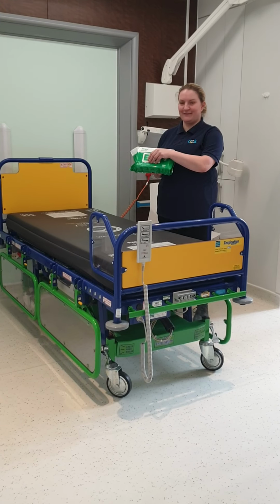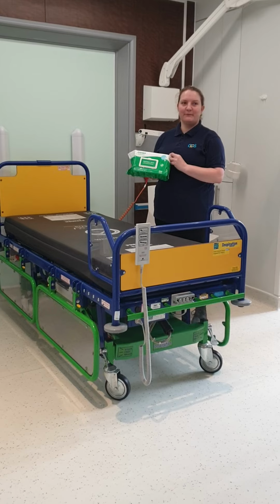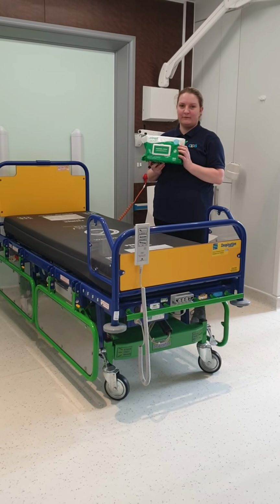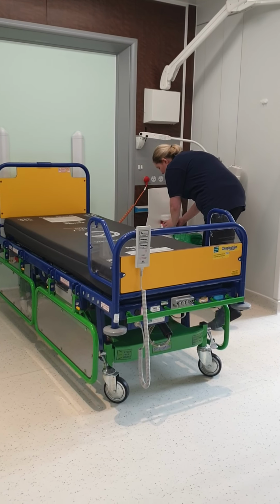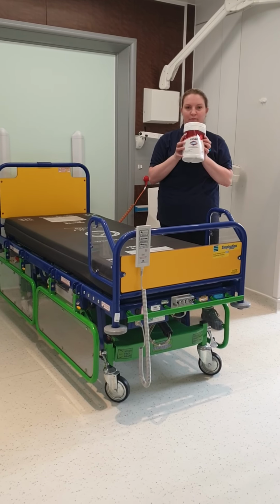This video is to talk you through how you would clean a bed if you're asked to support cleaning within a clinical area. The first step is to choose your wipe. We're currently using the green Clinel wipes. If you're asked to use the red Clorox wipes for any reason, you will be told what personal protective equipment you will need to be wearing when cleaning with this wipe.